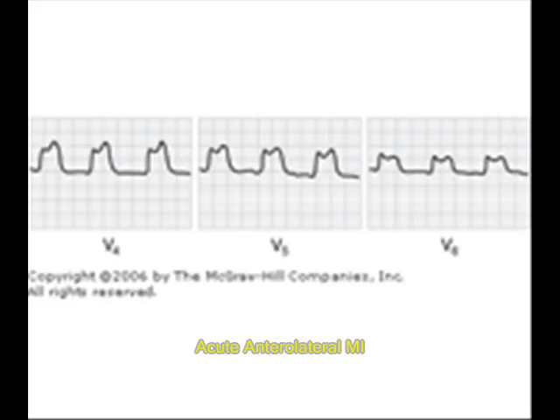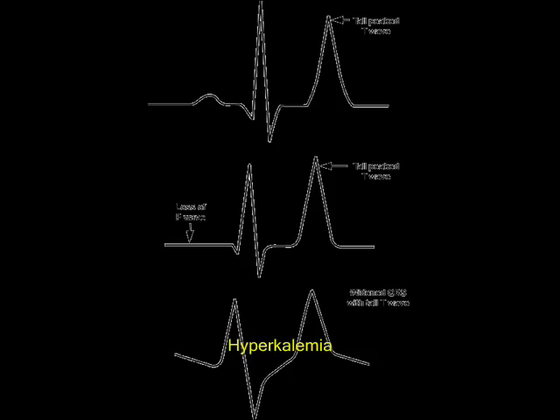Now let us see abnormalities in electrolyte disturbances. First, hyperkalemia. In hyperkalemia you will see big tent-shaped T waves. You can see here very clearly — the T wave is as big as the QRS complex. This is very characteristic of hyperkalemia, that is high potassium level in the blood.